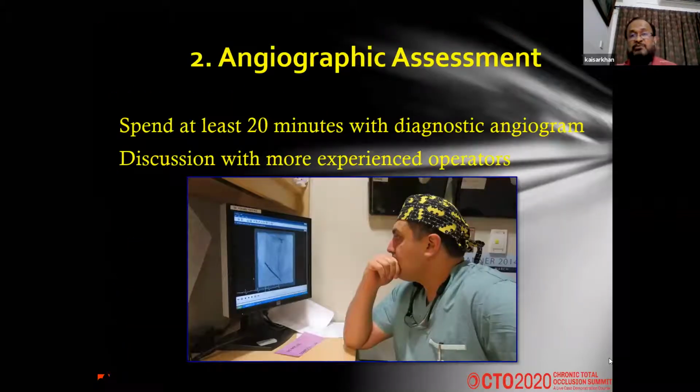And spend at least 20 minutes with diagnostic angiogram. Discuss with your experienced colleagues. There's no shame, no ego.